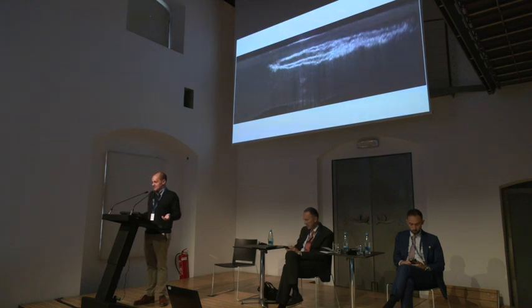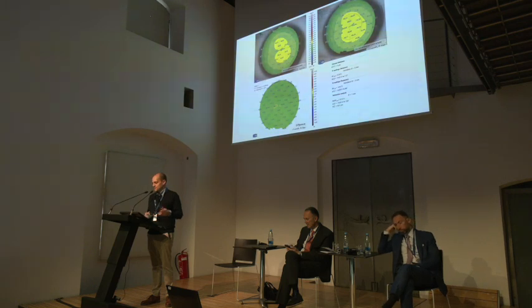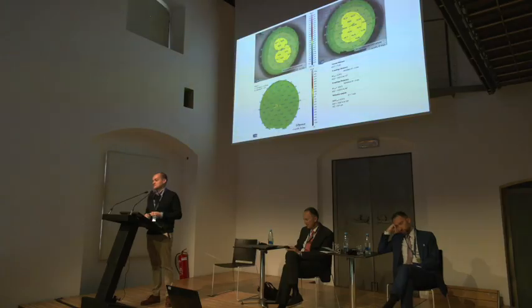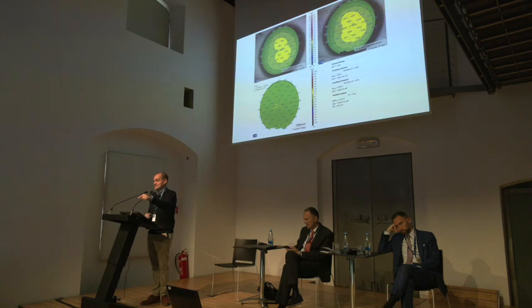Well, using the magic of CSO software, we took an image 24 hours after surgery, and we took the image from 1 month before the attempted surgery and compared the K values, the topography, densitometry, not densitometry, he promised to build it.